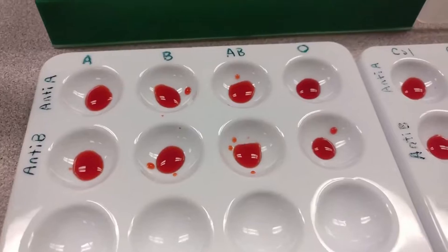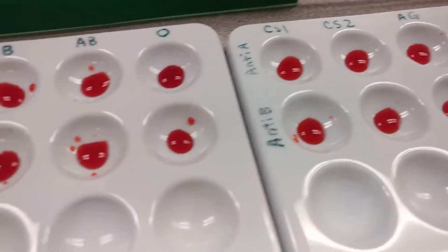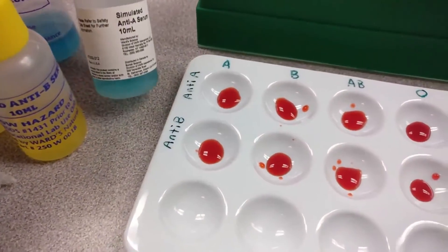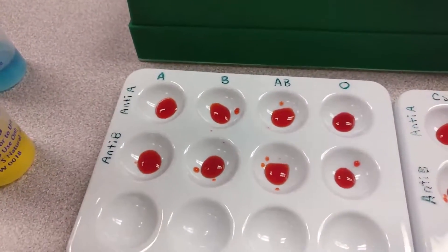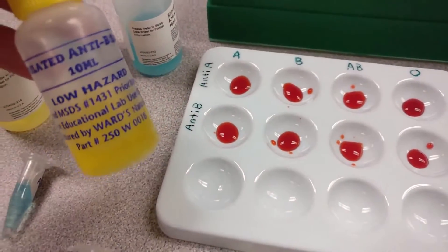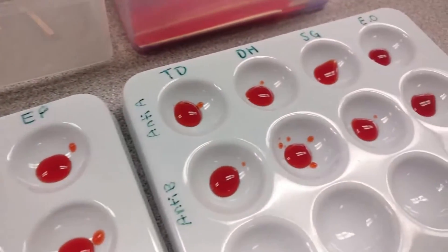This is what it looks like after all the blood samples have been aliquoted into each of these wells. Now I'm going to add, first for the top row, the anti-A serum — just a drop or two, maybe two to three drops in each of these wells so there's an equal amount. Then I will go through and put the anti-B serum and we will observe what happens to each of these.